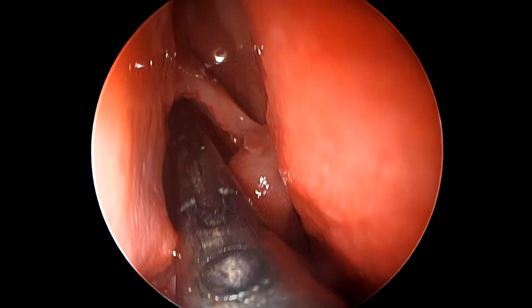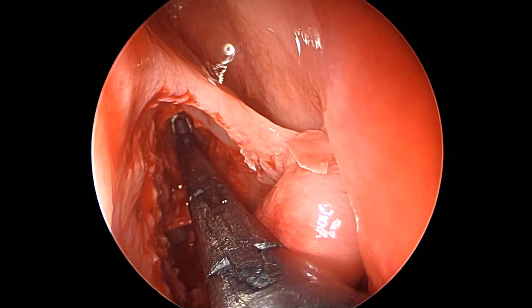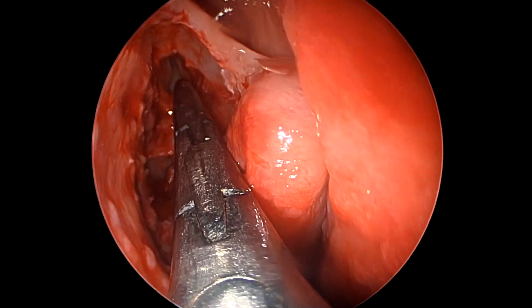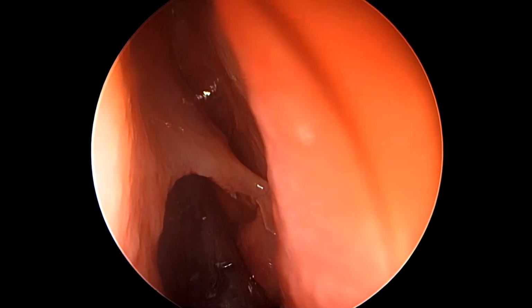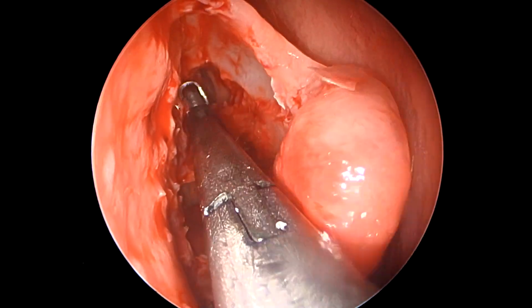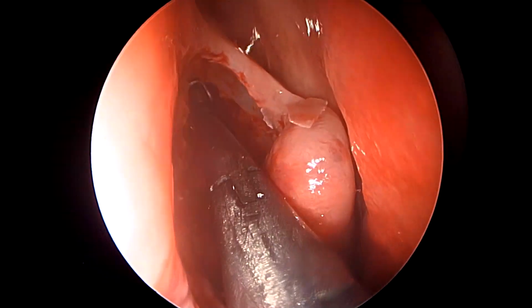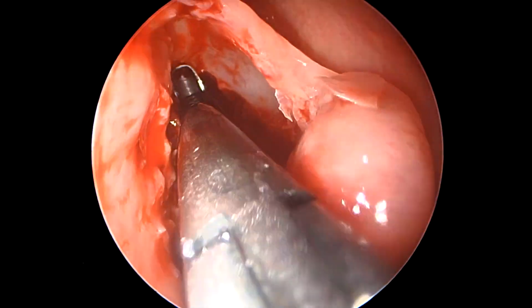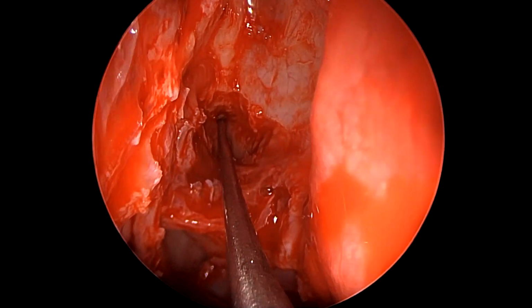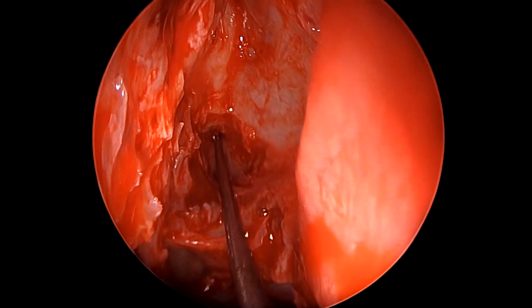Now this is again a tricky instrument to use because it's extremely curved, and the moment you put it inside, the visibility goes for a toss. Also, because of its unique curvature, it creates a sort of conflict with the endoscope, and often the moment we have engaged the bite of this against the beak of the frontal bone, we're not able to see very well.